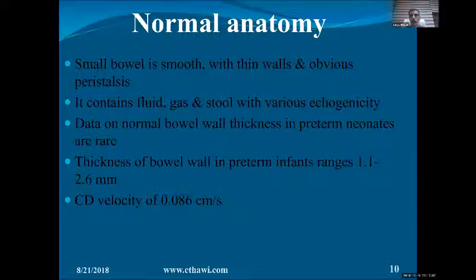If you are looking at a line graded from A, B, C, D, where A is the superficial structure and D is the deepest, in continuous Doppler you will look at all of them at the same time and you will not differentiate between them. Which means you don't have a gate.